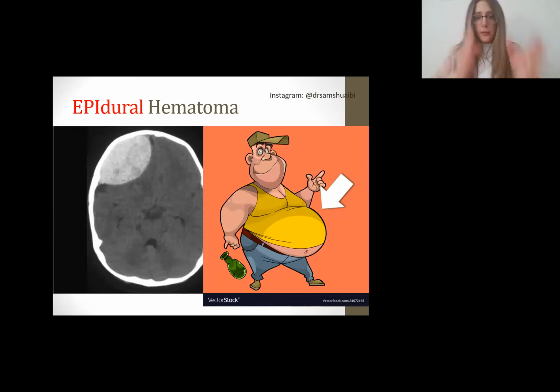Now you've got to keep your eyes open, and let's see how I can teach you these. These are examples of super high yield stuff that will come on your exam. So you will not graduate from med school, and you will not sit a single Western exam without being subjected to one of the following that I will be viewing for you.